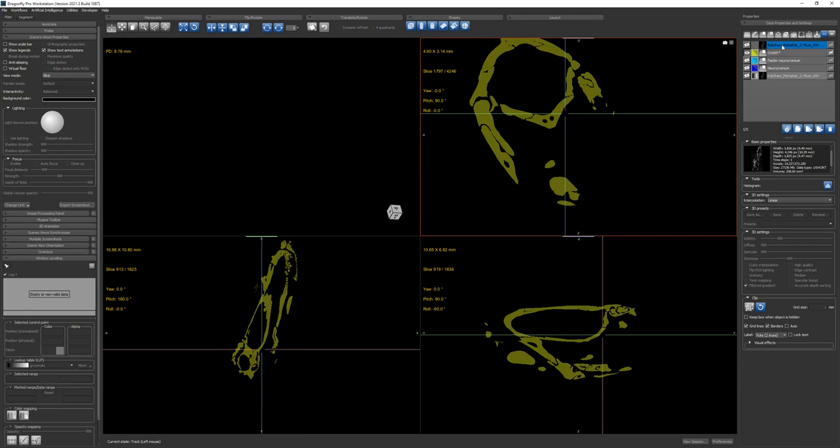We're going to double click, and that allows you to edit the name. It'll add copied to the end, but it's too unwieldy when it's this long. So I'm going to say it's data copy. Or if we were doing the neurocranium, because ultimately this will be our neurocranium, I will name it neurocranium.